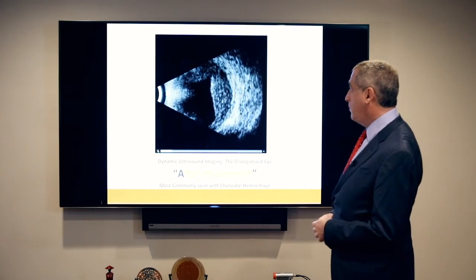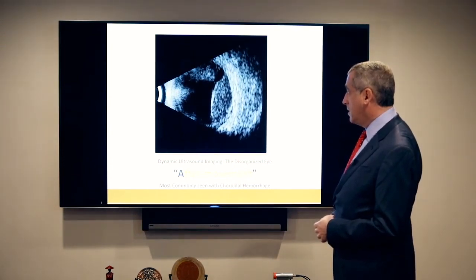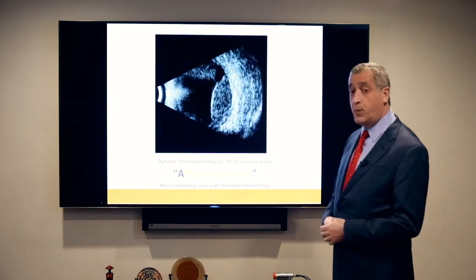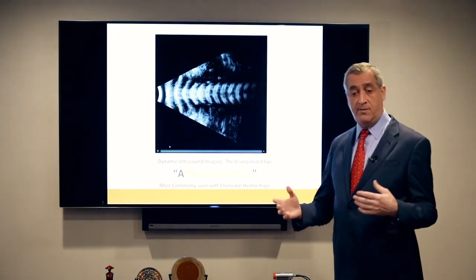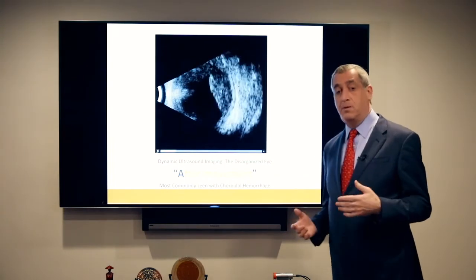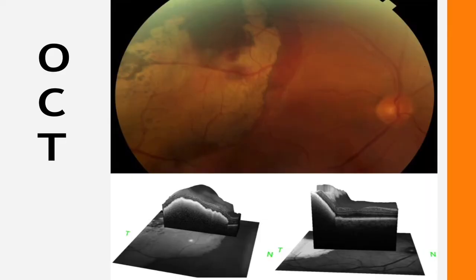Here, when you move the eye, the contents sludge. There's no twinkling like the vascular pattern with a melanoma. There's just this after movement of material underneath the retina that can't stop until it comes to rest. On the OCT, we see a very irregular surface, almost corrugated.